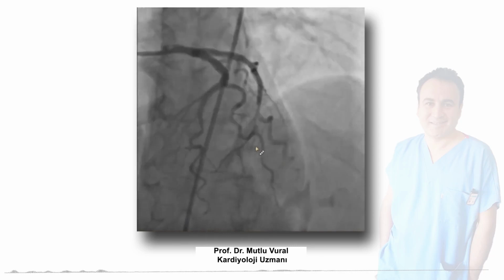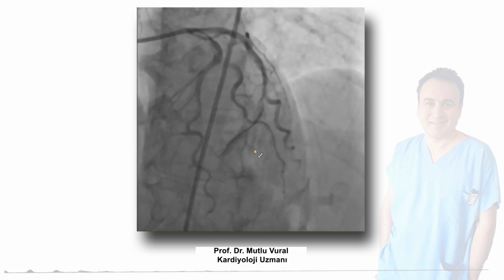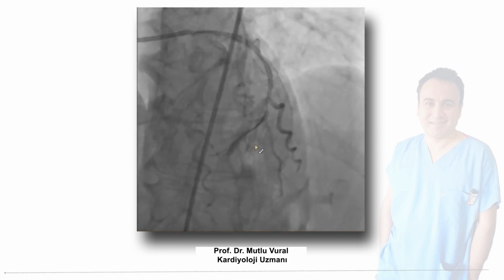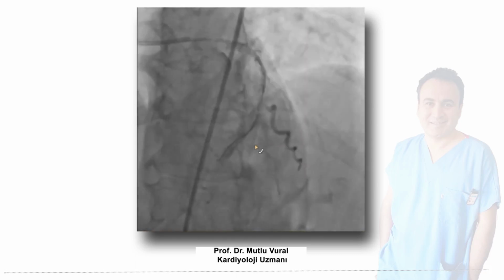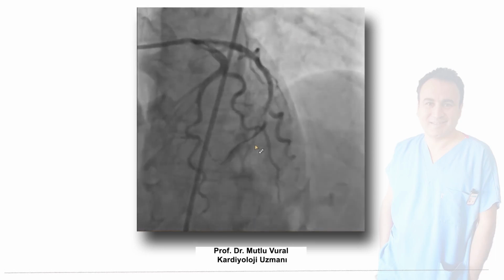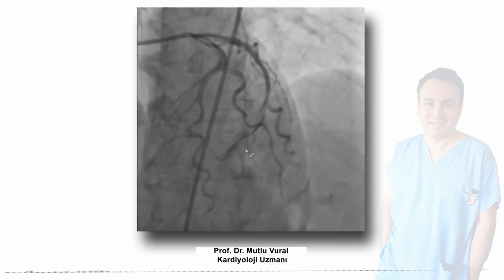But unfortunately, my colleague thought that this is a big branch, although it was rupture, and there is opaque remaining in the pericardium or wall of tiny branches. I don't know, but I think that there is no big branch here because RCA is dominant.